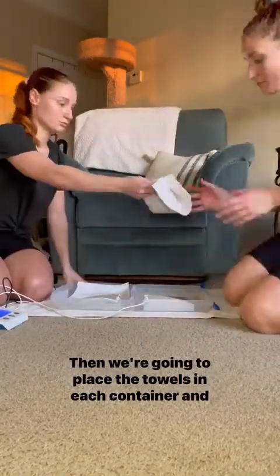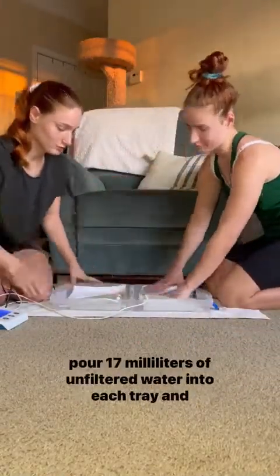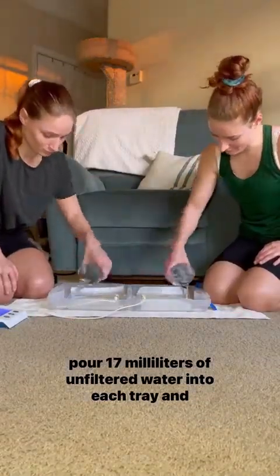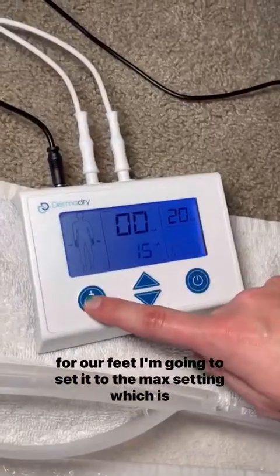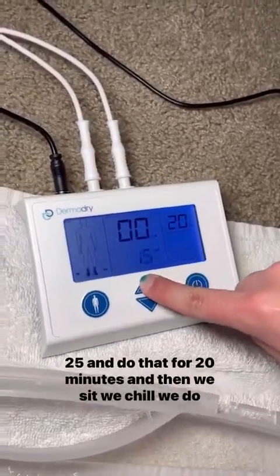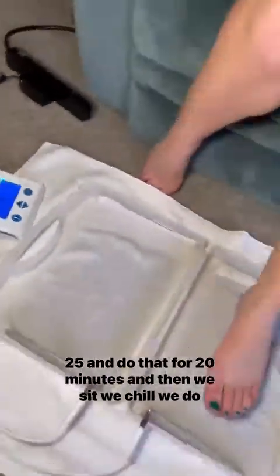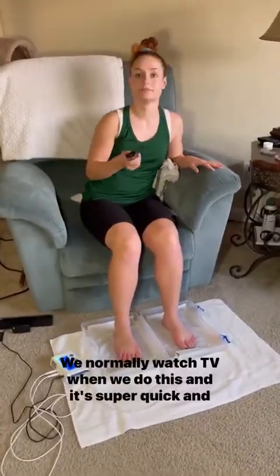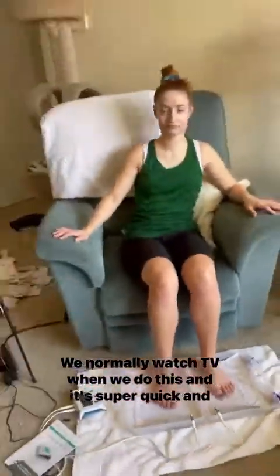Then we're going to place the towels down in each container and pour 17 milliliters of unfiltered water into each tray. And for our feet, I'm going to set it to the max setting, which is 25, and do that for 20 minutes. And then we sit, we chill, we do our treatment, and that's it. We normally watch TV when we do this, and it's super quick.